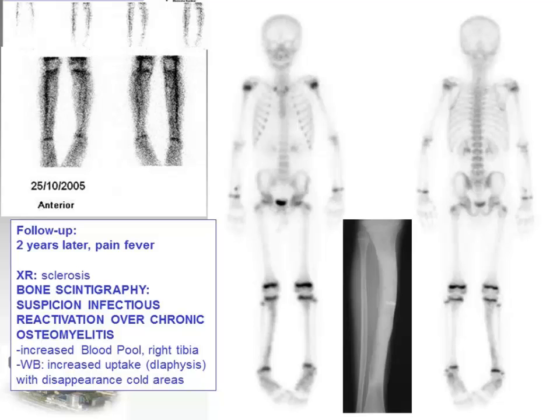It is possible, but we cannot be sure, because after a fracture or after osteomyelitis, the bone scan can remain positive for years. In this case, the positivity of the blood pool suggests a reactivation of the osteomyelitis, but it's pandiaphyseal and it's not clear. What do we have to do?